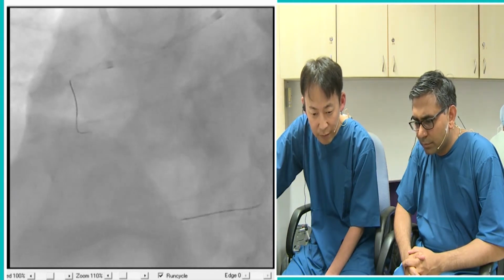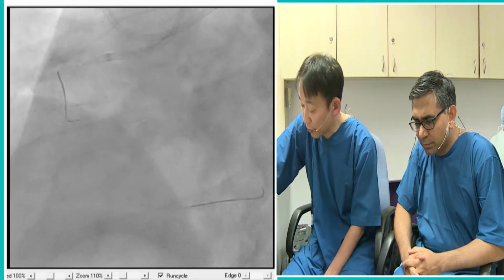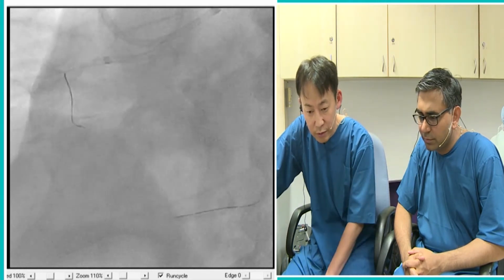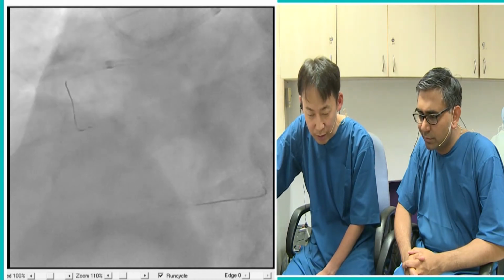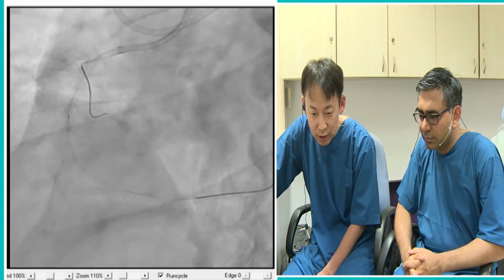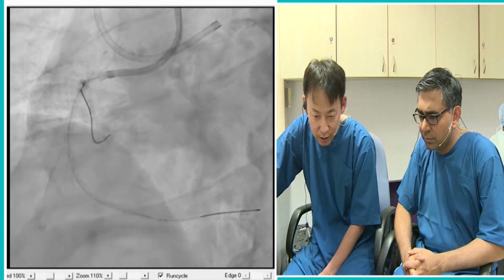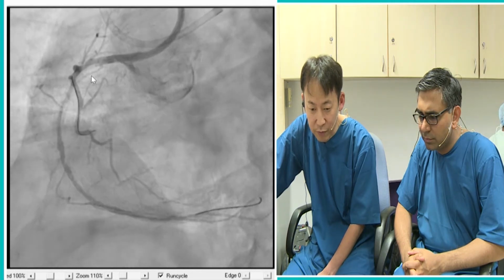And then I dilated with the Raise, which comes from Terumo. It's a very new balloon. I think this balloon is one of the most promising balloons for CTO intervention. So the Raise can easily go past the region and dilate, and this is the angiogram, so that you can see some distal region in the proximal CTO site.